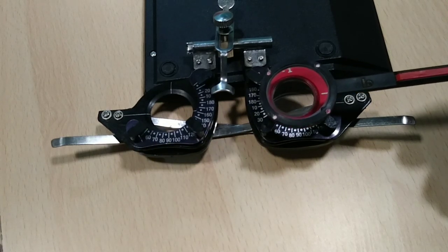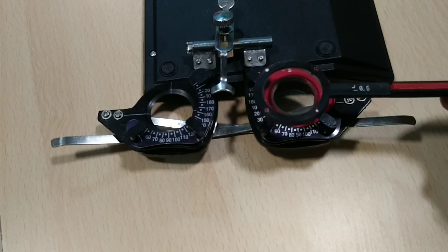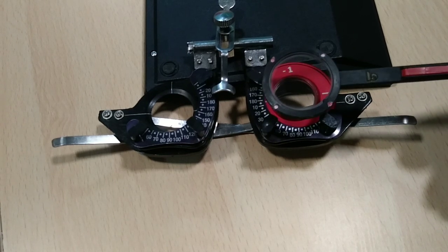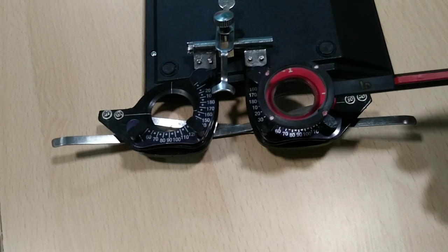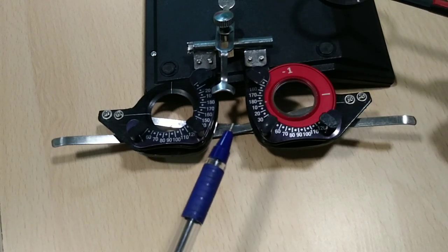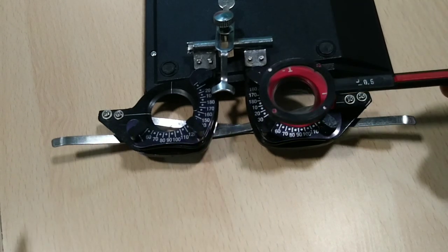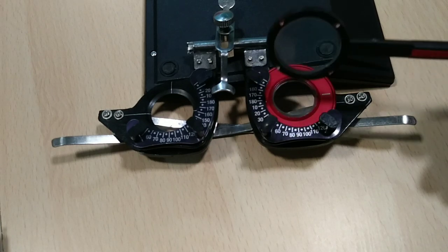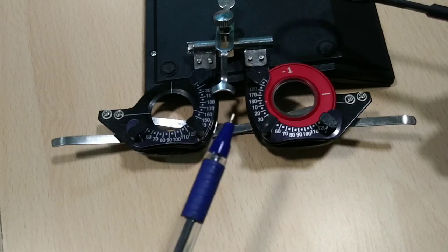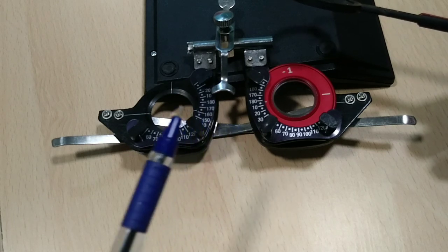Ask the patient to observe the target — one or two letters, not all — and show position one and position two, observing the patient's response. If the patient says both are blurred, that means the axis given in the subjective refraction is correct. If the patient says one position is slightly better and the other slightly blurred, that means the axis given in the subjective refraction is wrong and we need to refine it.